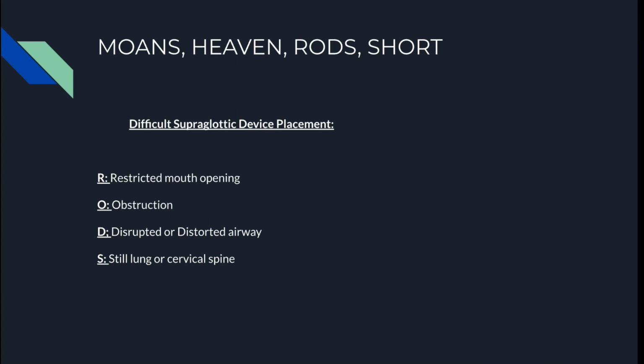And the other thing to consider, with the iGel aside, is that these devices generally have large cuffed balloons that need to be inserted. And so if we can't open the mouth wide enough, or if we're forcing it in, we may rupture the balloon. Obstruction, so any real true contraindication for these is any upper airway obstruction. And this could be from soft tissue trauma to burns, or whatever other situation. This definitely needs to be something that we consider.